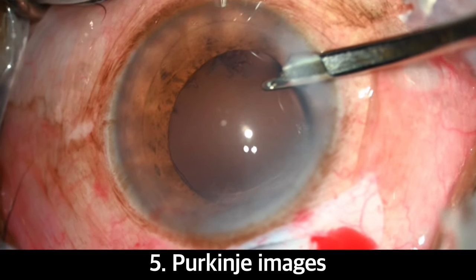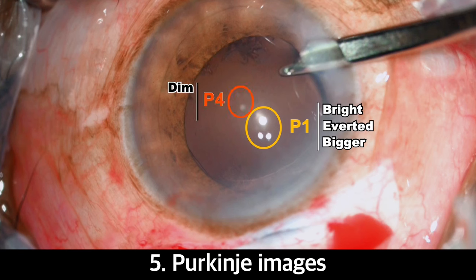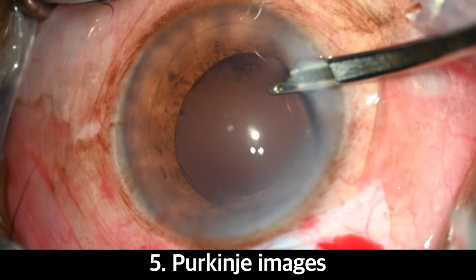Here you can see the first Purkinje image, which is bright, everted, and bigger, formed on the anterior surface of the cornea. And the fourth Purkinje image, which is dim, inverted, and smaller, is formed on the surface of the posterior capsule. This sign confirms the intact posterior capsule.